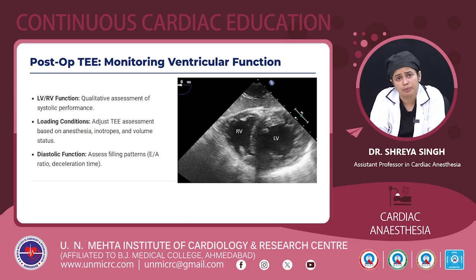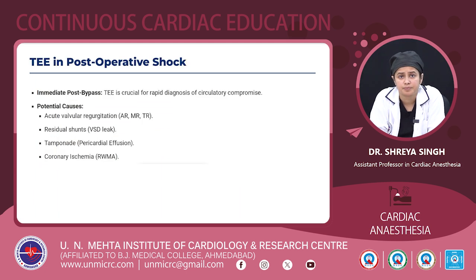In the post-op period, we can monitor the ventricular function. We can qualitatively assess the systolic performance. We can adjust the assessments based on anesthesia, inotropes, and volume status, and also assess the diastolic function. Also, in post-operative shock, TEE is crucial for rapid diagnosis of circulatory compromise. Potential causes could be acute valvular regurgitation, any residual shunt, tamponade, or coronary ischemia.